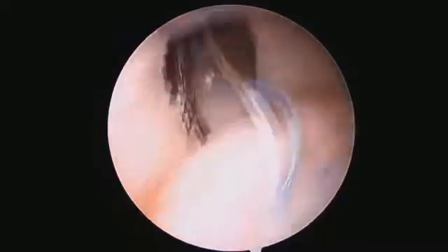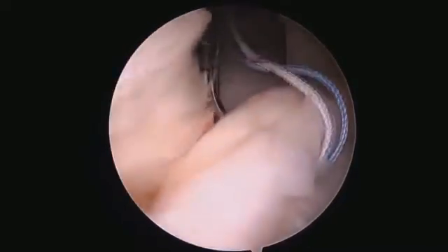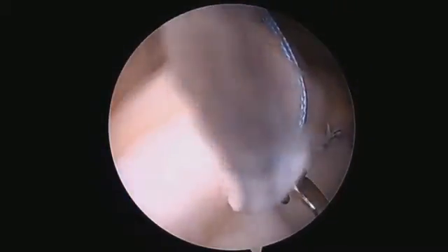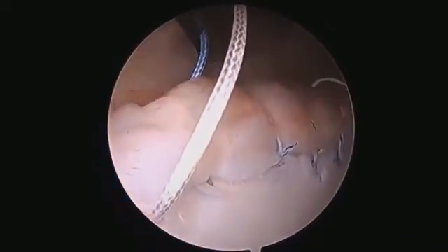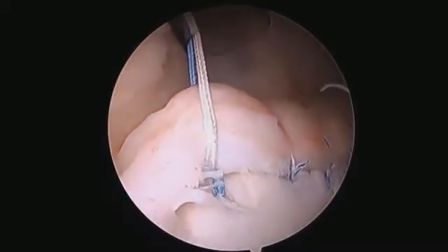Here's where it's different. It looks like two strands, but they're actually woven together as one. A bird beak suture passer is being put in, and of course it's the colored strand you're wanting to grab — that colored blue strand that goes through. It has to be the colored one that goes through for this to work appropriately.